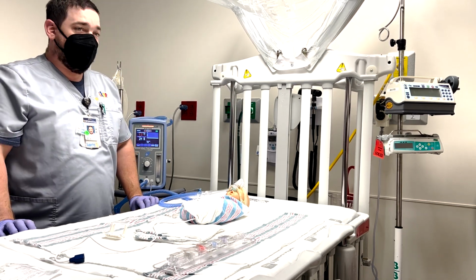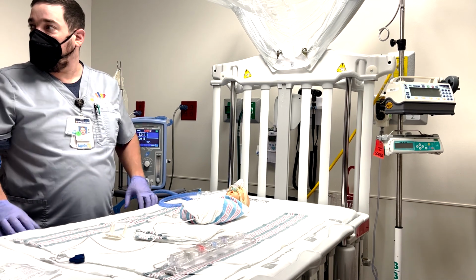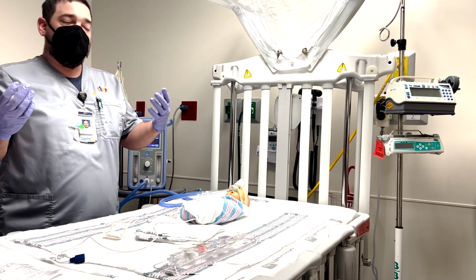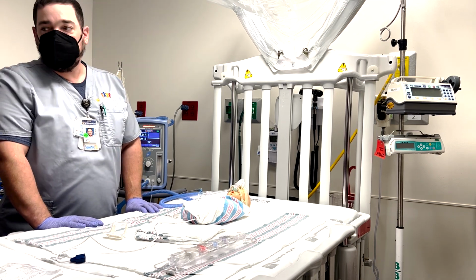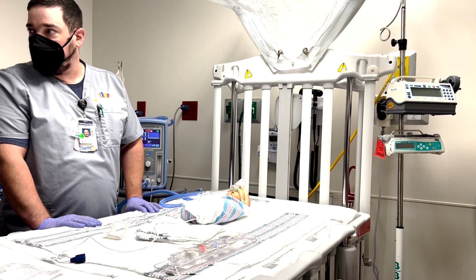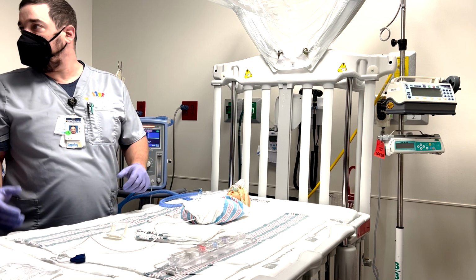But if it's within reason, if I've got a low O2 requirement and they're on 7 and they don't have obvious signs of respiratory distress, I'm willing to work a little bit with that. And it's tough because it is a guidelines world. If you have a subjective concern about the patient, though, we should be pushing to escalate. It's just the way of it.